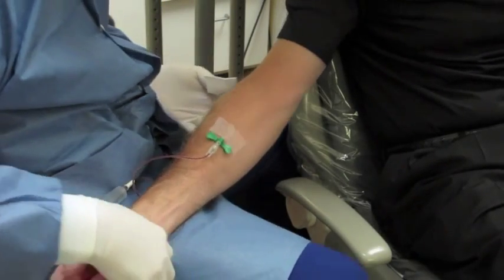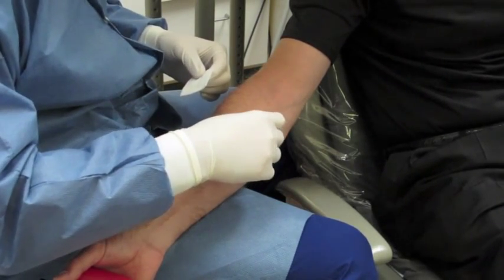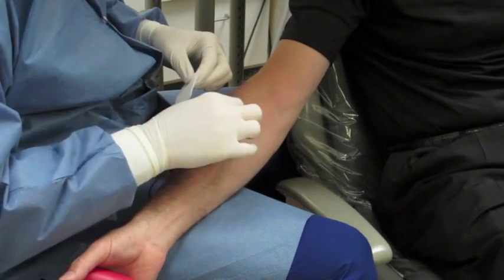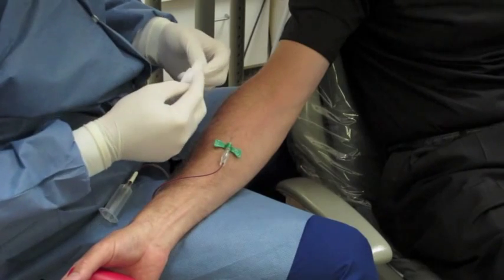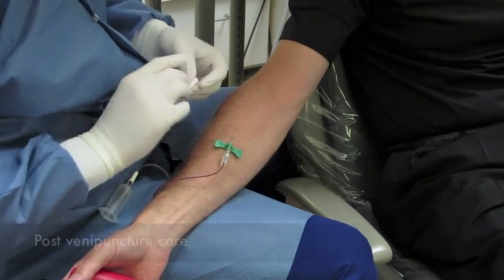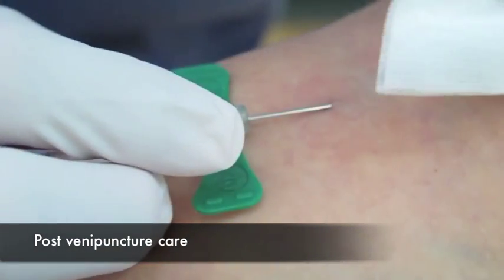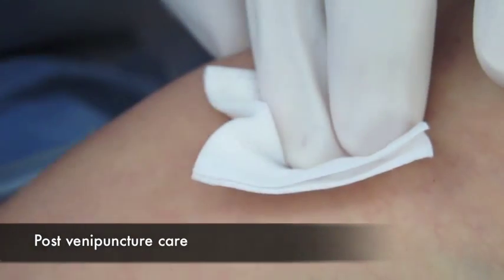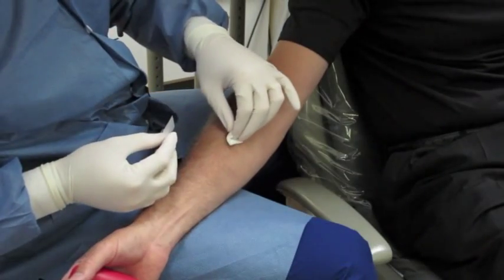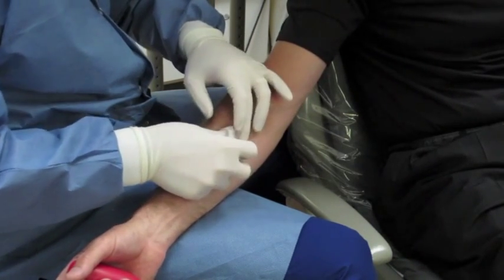After you've completed that, remove the needle from the vein. This particular butterfly needle has a push-button safety feature that will retract the needle so you won't stick yourself, the patient, or your assistant. Get your gauze ready before you retract the needle, then push the safety button, retract the needle, and place the gauze over the vein to compress it and stop the bleeding. Check before placing the tape to make certain there's no hematoma forming, and if all looks well, go ahead and tape it down.